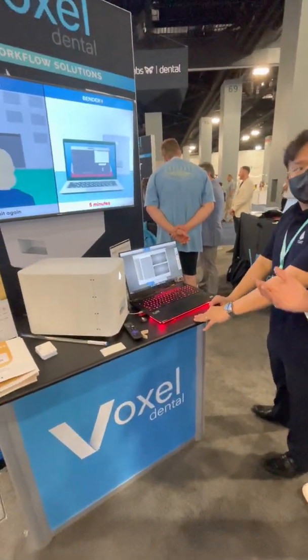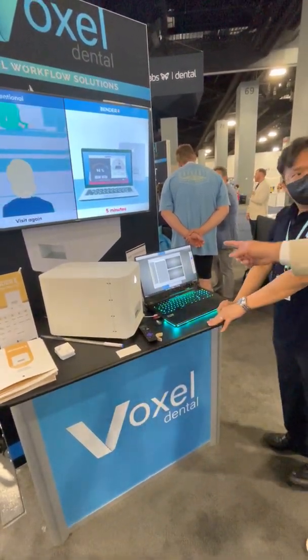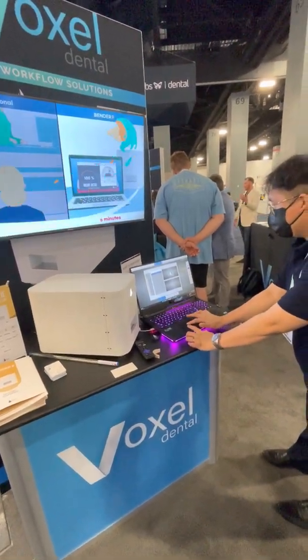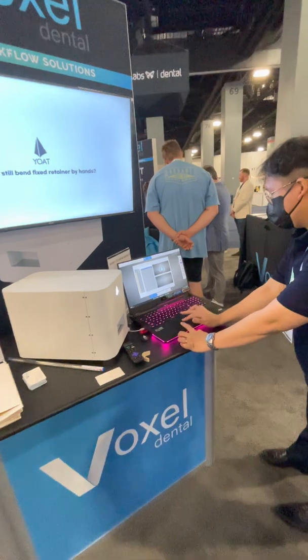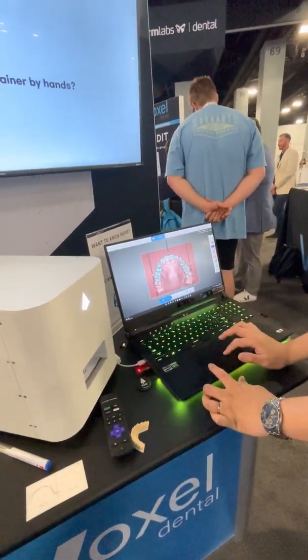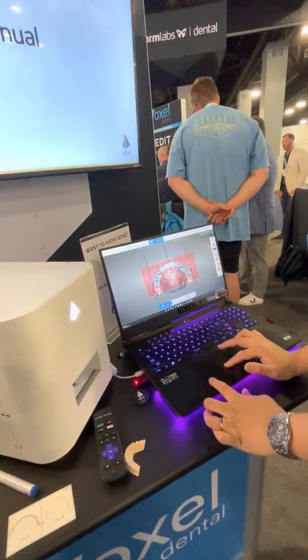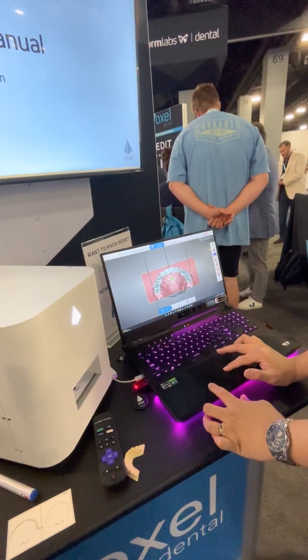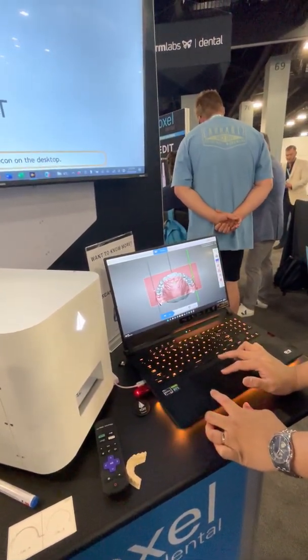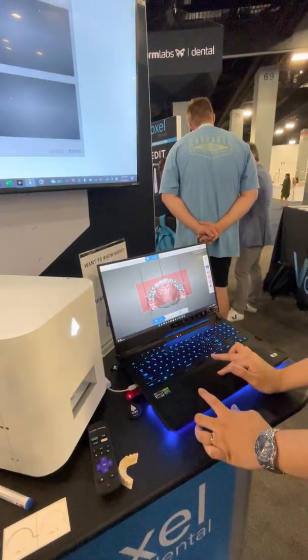Once we've taken that scan, we're ready to build a lingual wire chair-side while the patient's waiting. You simply grab those files — it's drag and drop technology. He's going to throw in the upper and then the lower. You'll see it quickly show you the model, and then you'll be able to adjust the plane and the height, wherever you want that wire. The wire is going to be bent right at the cross section between the white and the red on the lingual side of the teeth.